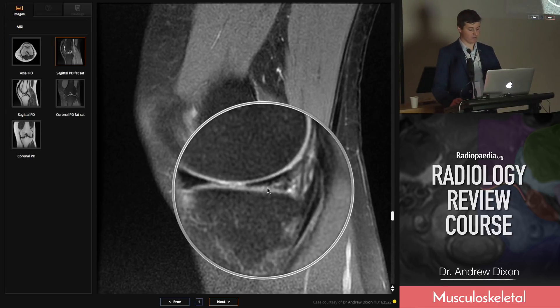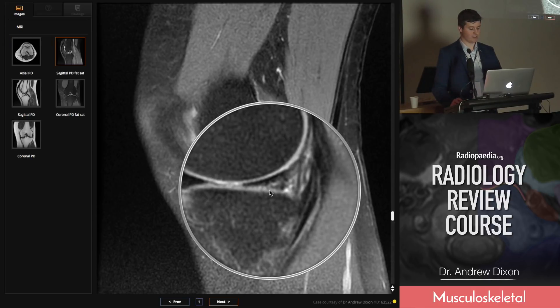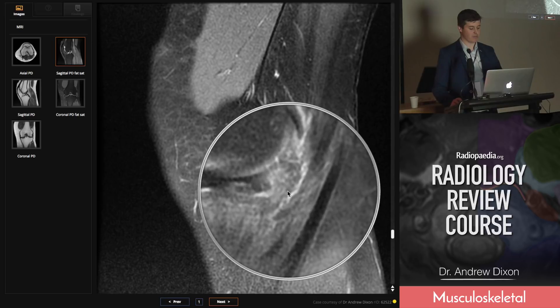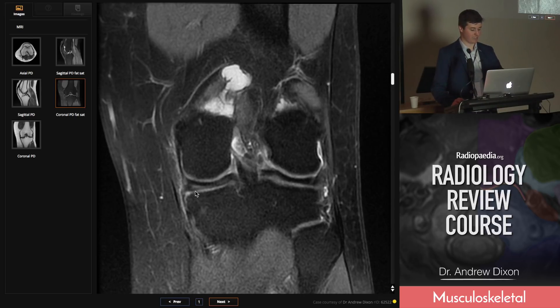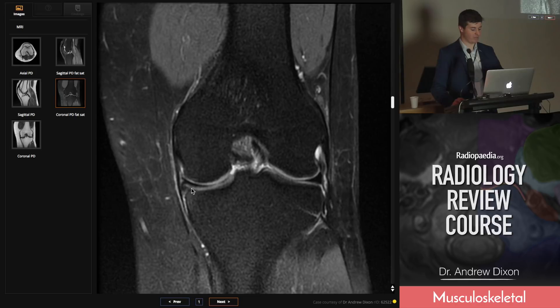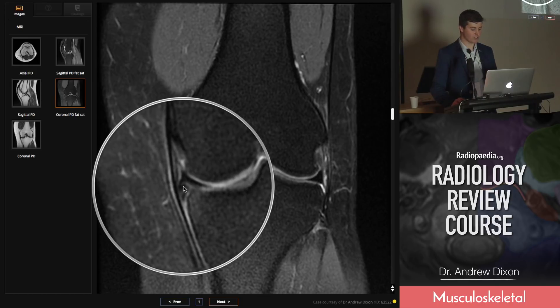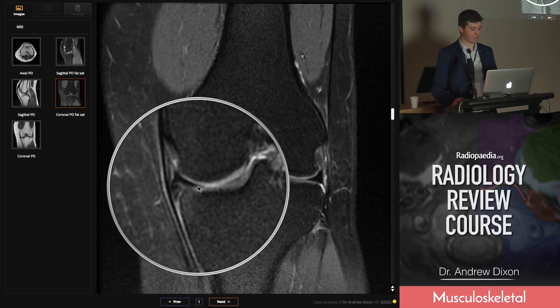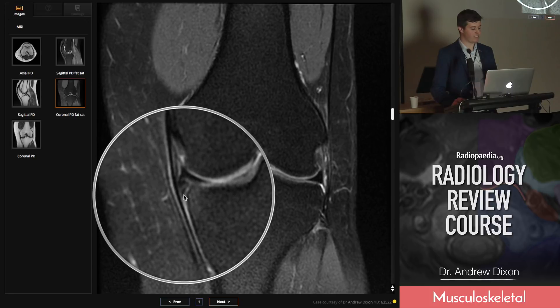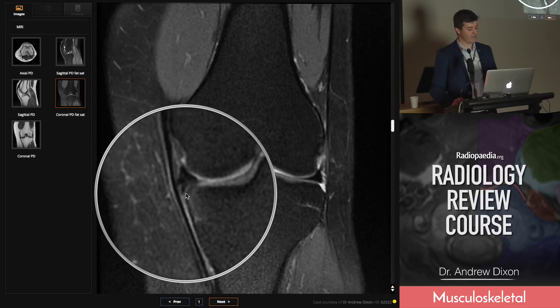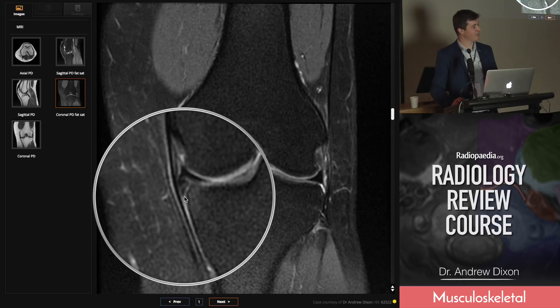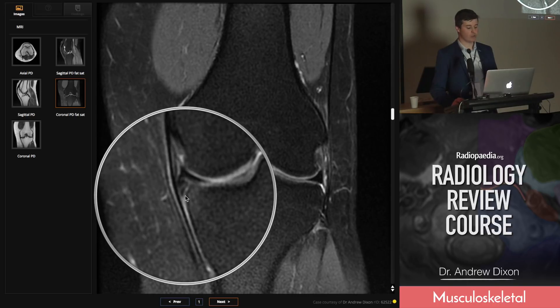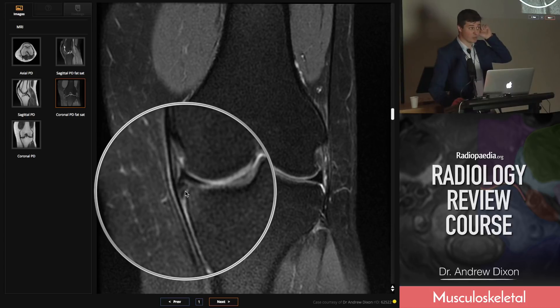Here's another case: a degenerative horizontal tear of the posterior horn of the medial meniscus with a bit of meniscocapsular inflammation. On the coronals you can see it extends around into the meniscal body. If you look carefully, the inferior aspect has actually become flipped down into the tibial recess. These are really important to identify and easy to miss because they're small.